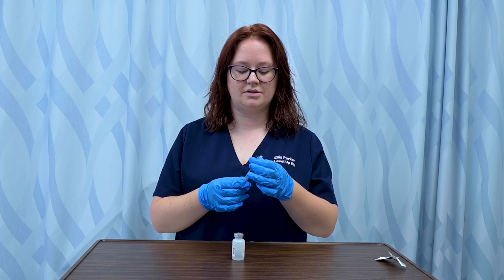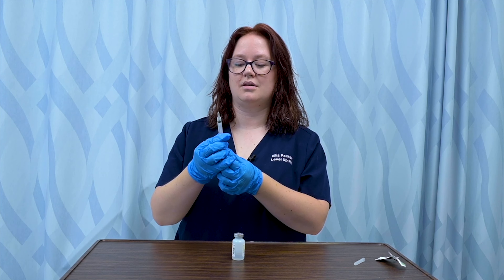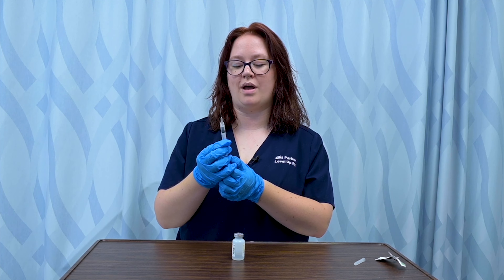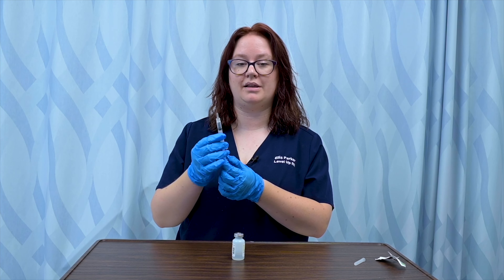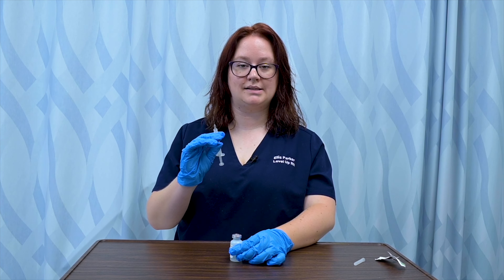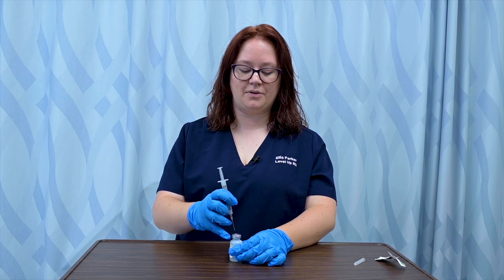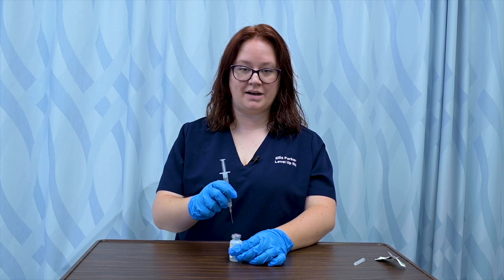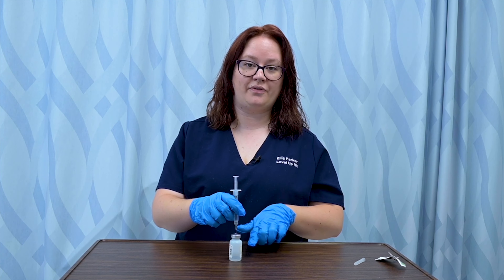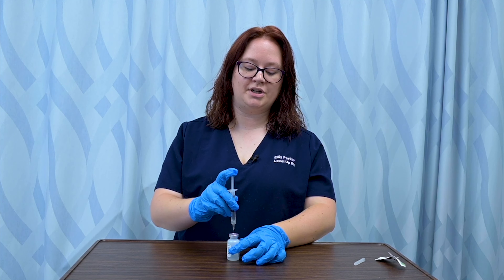I'll then get my needle and syringe. I'm going to remove my needle cap and pull up the amount I'll be withdrawing — let's do one milliliter today — so I pull that plunger back to one milliliter. I'll hold my vial steady on a stable, solid surface so I don't miss the vial when I go in with the needle. I insert the needle at a 90-degree angle, pop it right in, and into the open space above the medication liquid, I inject my air.